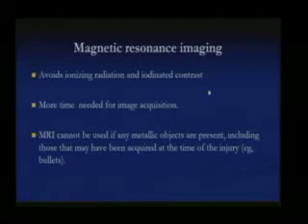The other imaging modality is MRI. You can make a point: CT has radiation, and we have to give contrast for a CT scan, so why not get an MRI? But it takes more time for image acquisition. It's cumbersome, takes a lot of time, and cannot always be done. Sometimes these injured patients have metallic objects, and we don't know whether the patient has something which can interfere with the MRI machine. So it's safer to get a CT scan in case you're concerned about thoracic aortic injury.